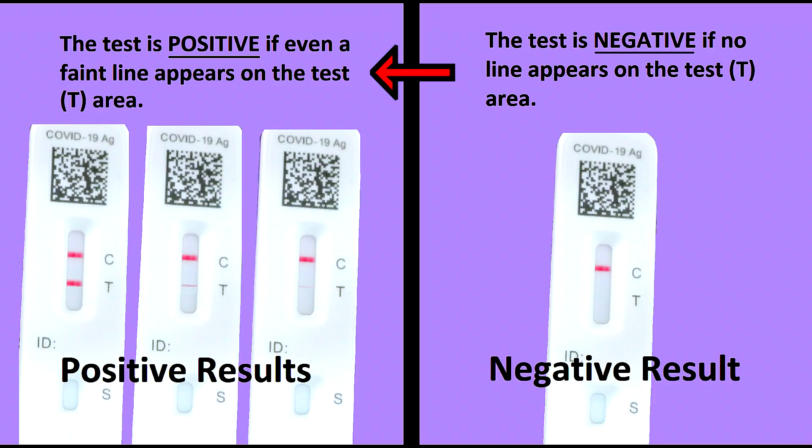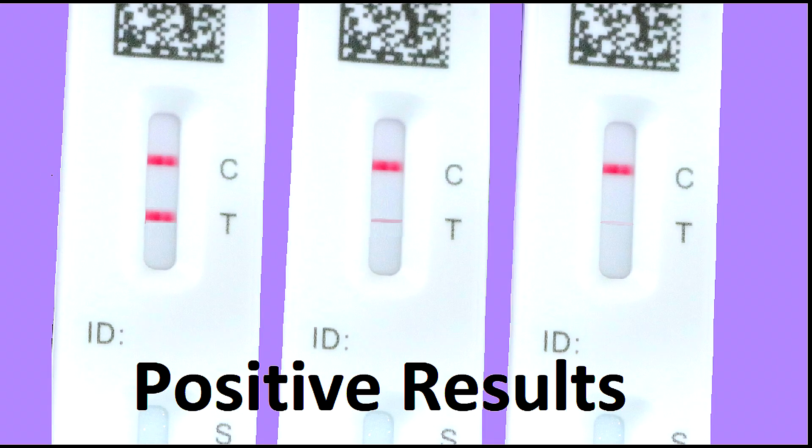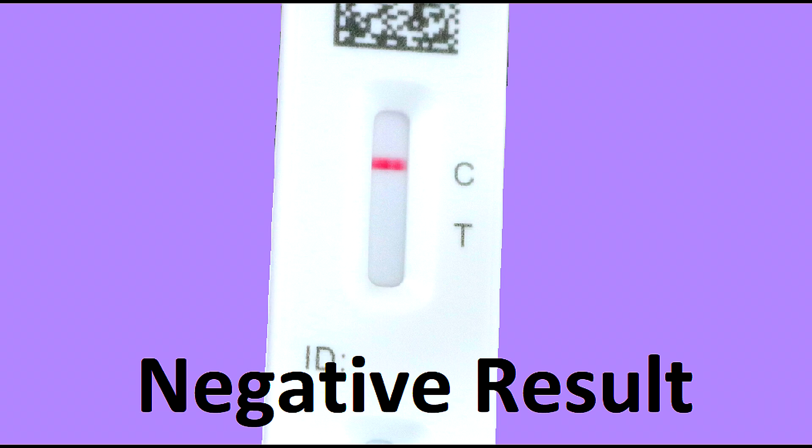Here is what a positive test result looks like. Notice there's a line in the control area and the test area. And this is what a negative test result looks like. There is a line in the control area, but there is not a line in the test area.